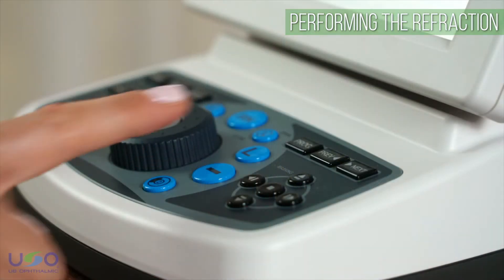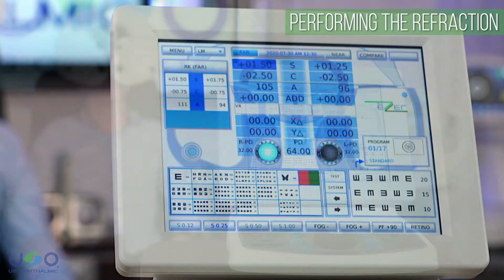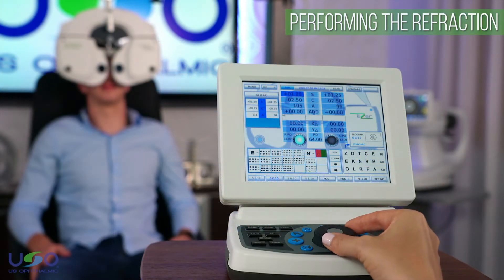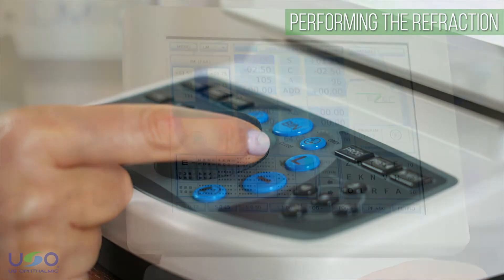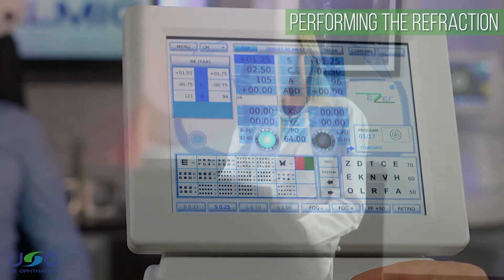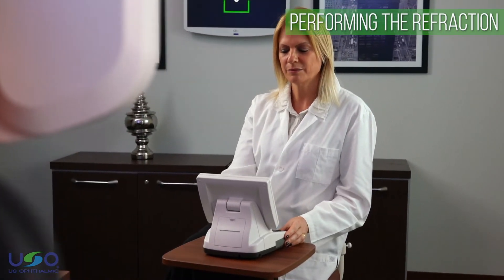You can start with a monocular evaluation of the right eye by automatically occluding the left eye. On the screen you can select the spherical power and modify its values by rotating the central knob of the keyboard in steps of 0.25 diopters in standard mode. The spherical power steps and the speed of change of the lenses can be customized to the practitioner's preference.